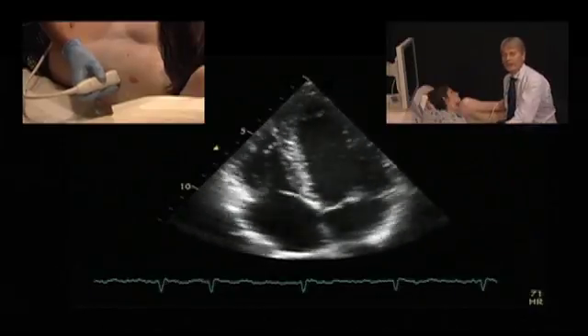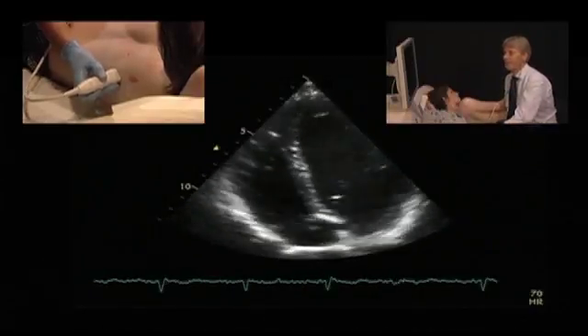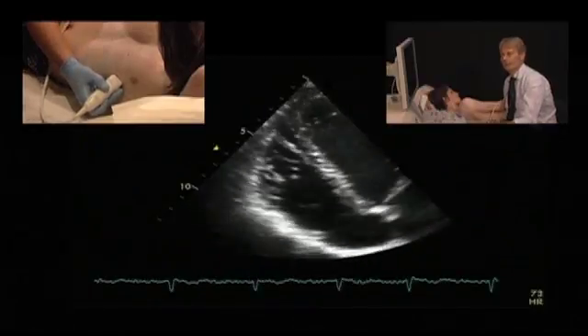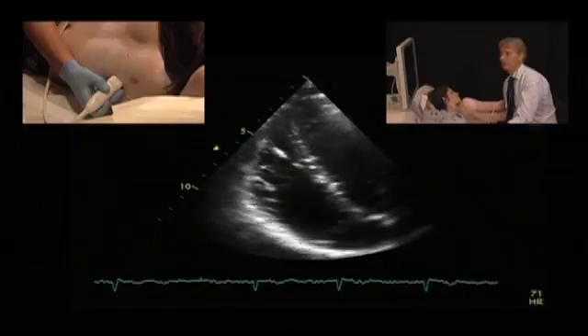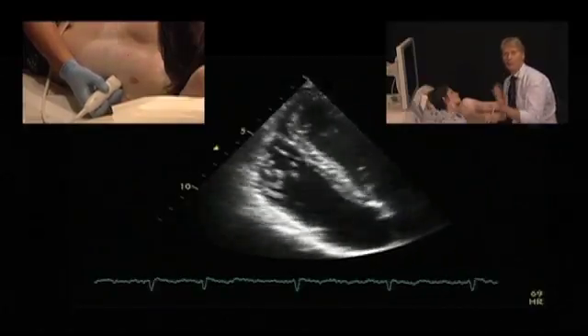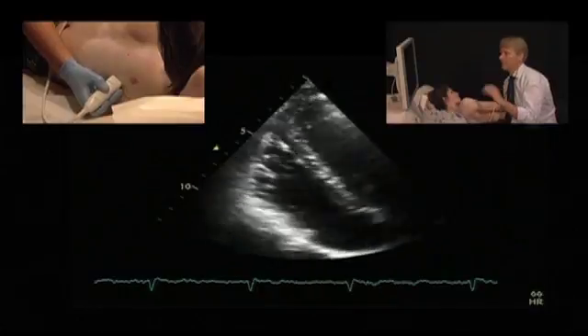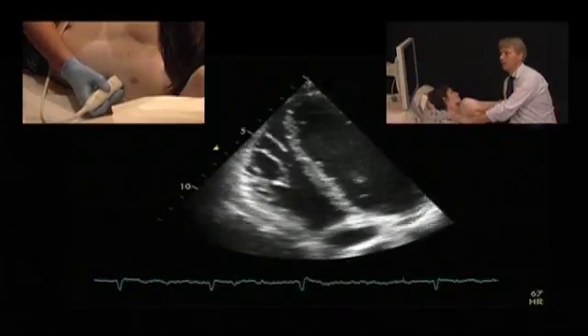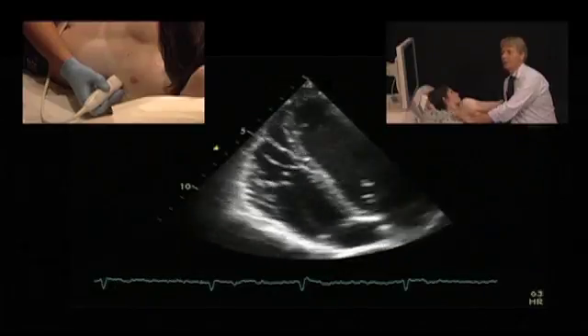There are ways of optimizing this view, and this is by simply moving the transducer more laterally and pointing the transducer more towards the right side of the body. Thereby you have a more perpendicular orientation of the ultrasound beams to the lateral wall, and you have a much better delineation of the endocardium.